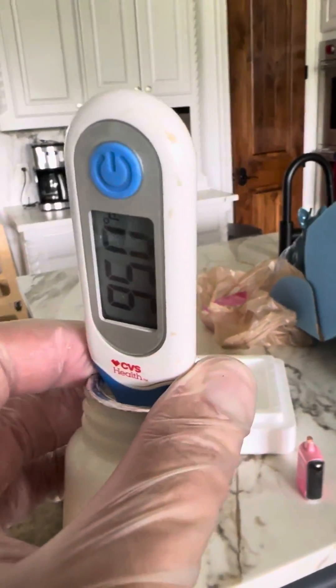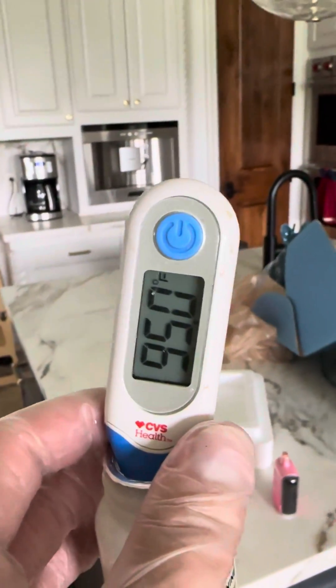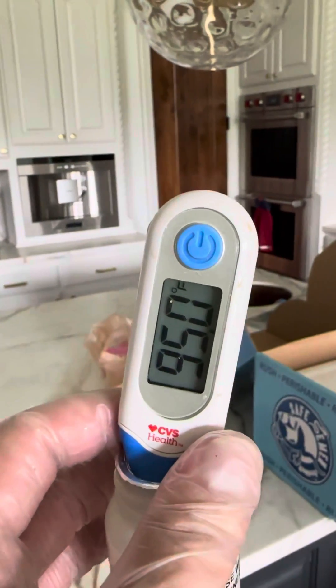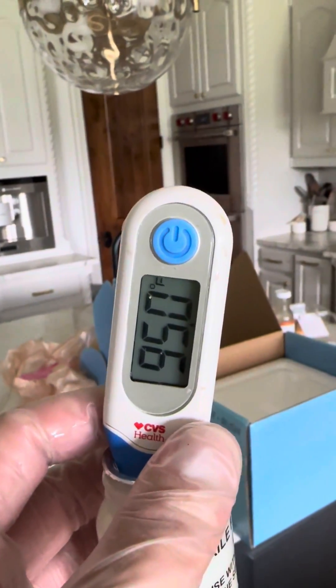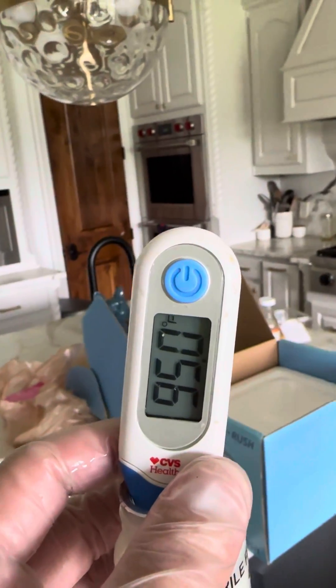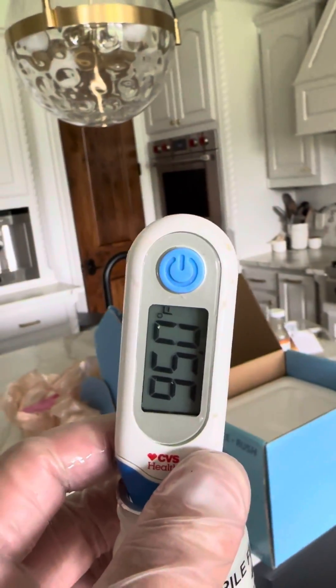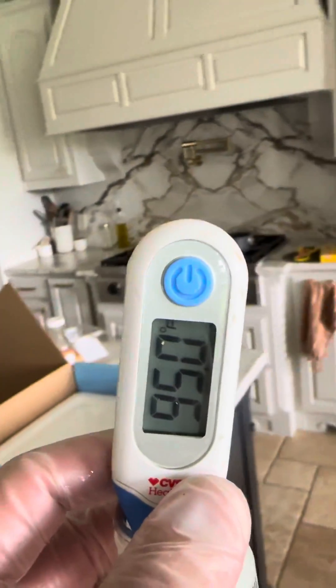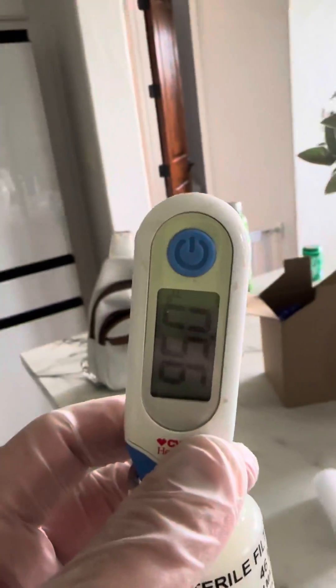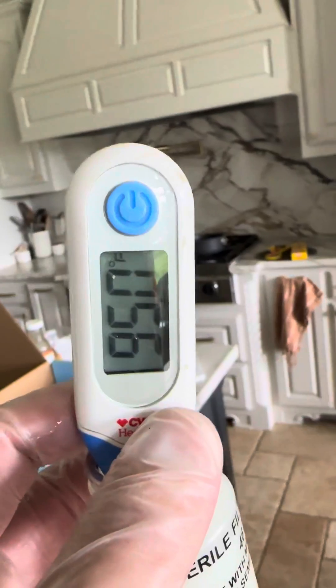Whenever you ship semen and you're mixing extender in, you're always going to want to check the temperature of the extender. As long as it's within about 5 degrees, you're not going to shock the semen, because the semen is going to be normal body temp, which is about 99 to 100 for dogs. So at 95, I'm good to go. I don't want to heat it too much and have it be too hot.